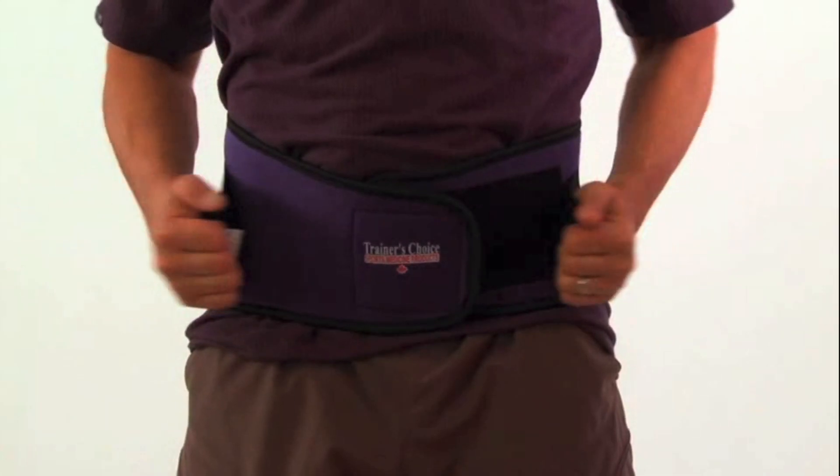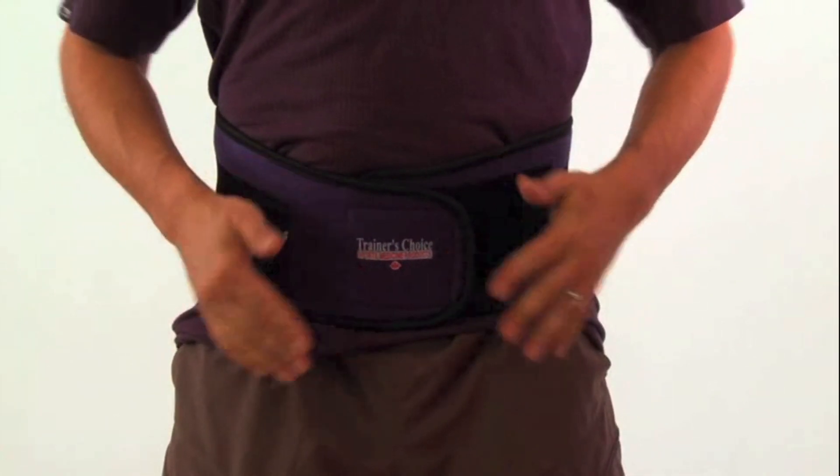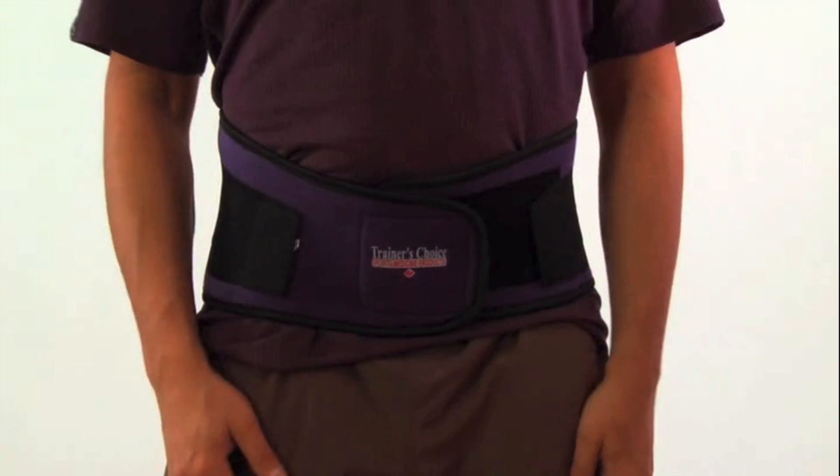To increase the support in the low back, adjust the tension of the side straps by pulling them forward and Velcroing onto the base.